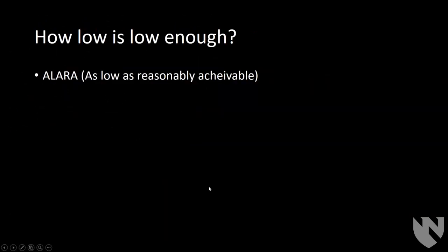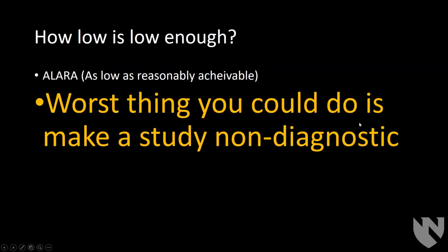So how low, though, is low enough for a patient? Well, you keep it as low as reasonably achievable, because the worst thing you could do is make a study non-diagnostic. To go through the whole effort of doing the study, but make such efforts to lower radiation dose to the point that you can't answer their question or you can't help the patient, well then whatever radiation you used was not worth it. And so you need to use at least as much and hopefully just enough to answer the question. Thank you.